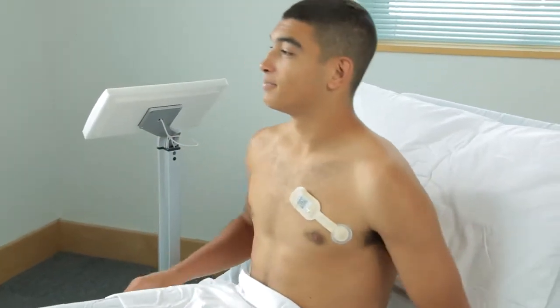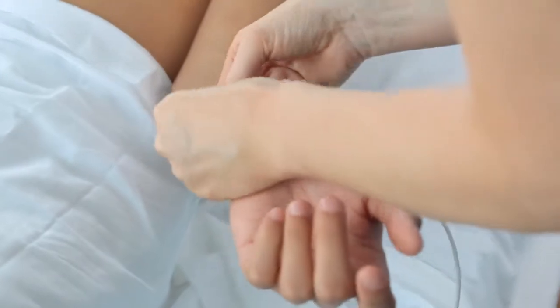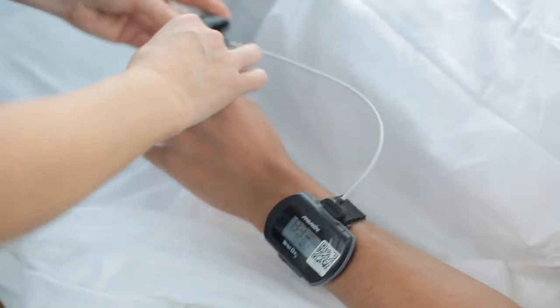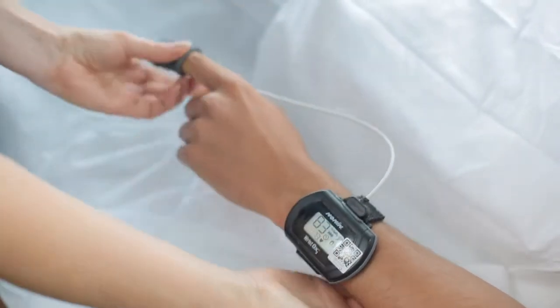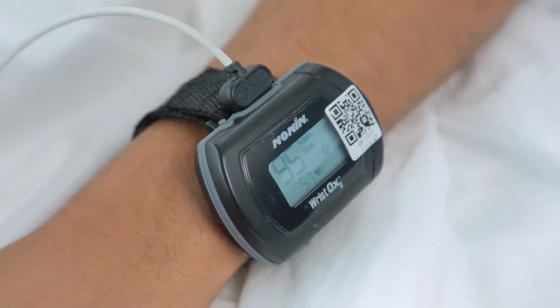So what this really is doing is digitizing the patient. So we are taking the patient's vital signs and immediately turning them into digital information. And in a way, it's exactly the same as a nurse coming around, measuring blood pressure, heart rate, oxygen saturation levels. But instead of writing them down, the system collects the data and immediately puts it into a data store and then displays that by the bedside.